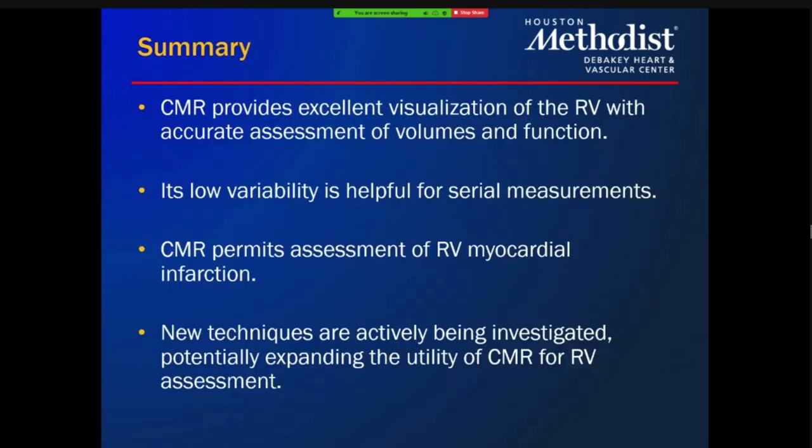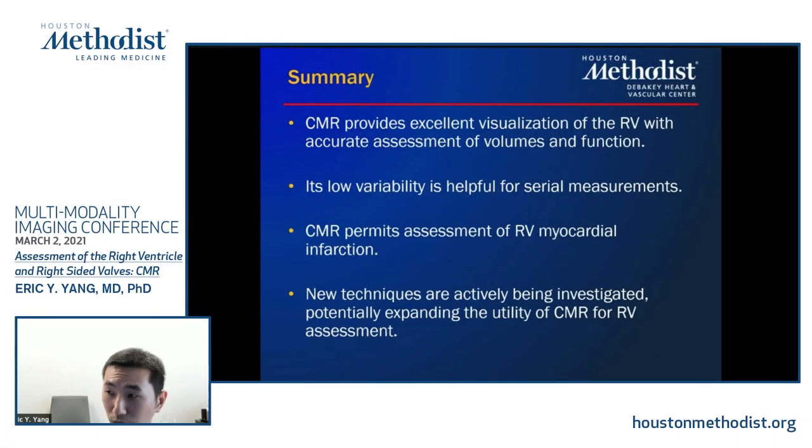So with that, I'd like to summarize, since we're a few minutes past the hour. I gave you a good talk about how CMR can give different pieces of information about the RV, about its size, its function. Hopefully I convinced you with the data I showed that it has very great reproducibility and repeatability, and hence its use for establishing accurate volumes and accurate EFs.